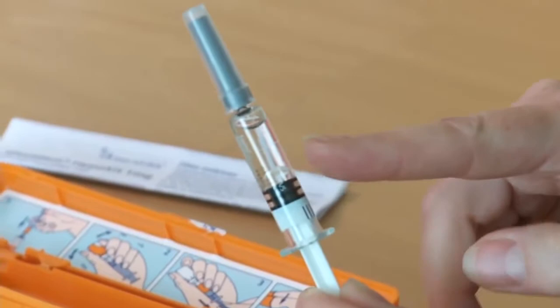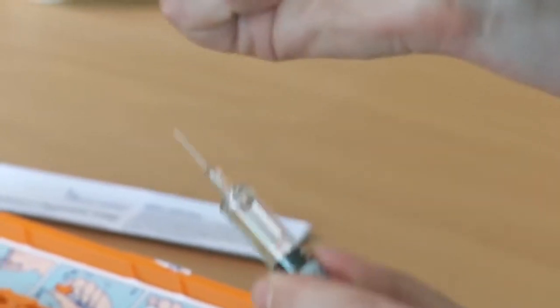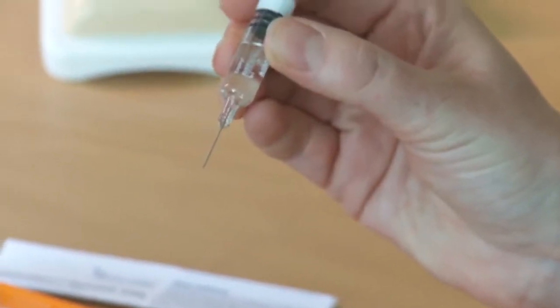Picking up the syringe, this syringe already has water in it, so it's ready to go. And a needle cover. You need to take the needle cover off. Now a lot of parents say that the needle looks really scary. It is quite a big needle, but this is going to be going into the muscle, and just to remind you that your child isn't going to remember this. So try not to worry about the size of the needle.